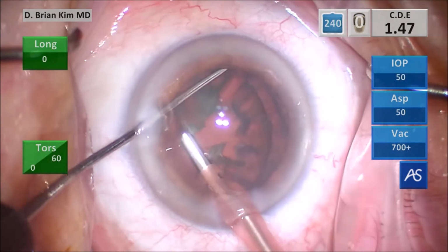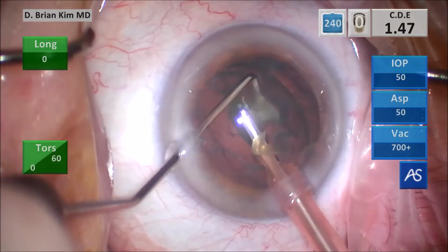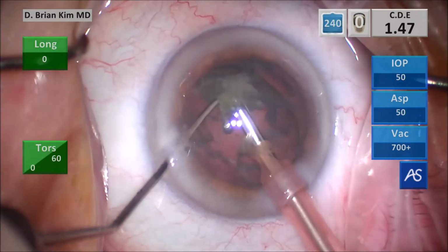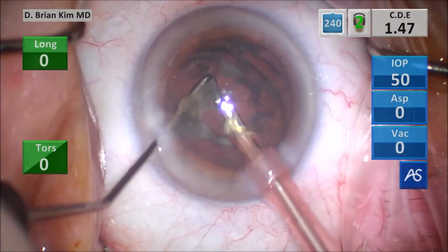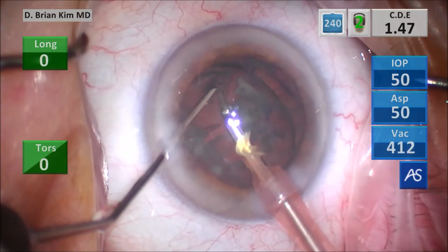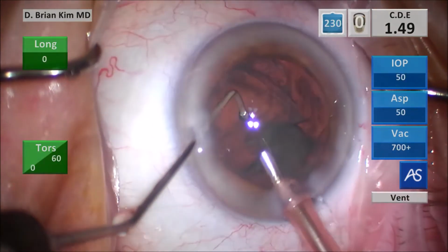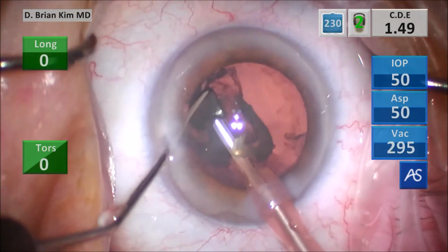So I just use a chopper to manipulate that last piece up out of the bag, using some vacuum to hold it and then crushing it in smaller pieces and then emulsifying the lens piece. Anytime I'm dealing with the last pieces, I'm just mindful that the bag is okay. In this case, I have a pretty thick amount of a stiff epinucleus. I feel pretty safe. So I remove that last piece and then I go after the epinucleus, which comes out quite easily. Again, it's real thick and stiff, so I have to very carefully and slowly remove it with the high vacuum.